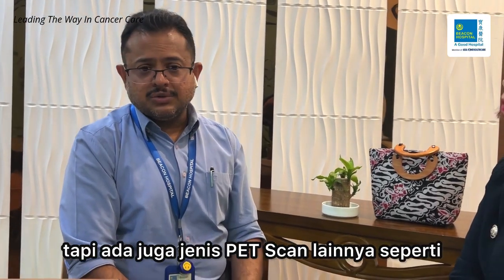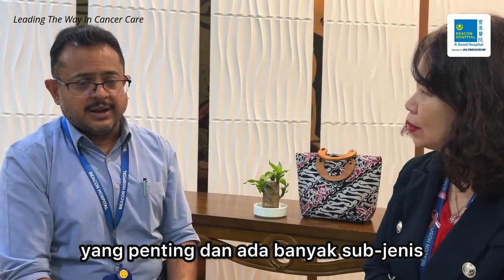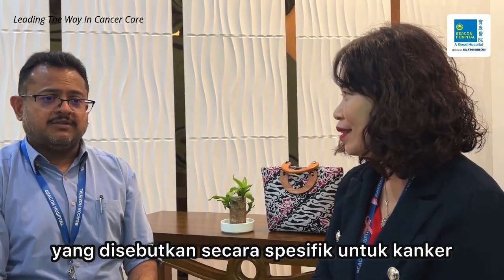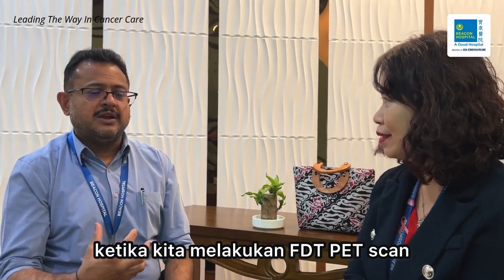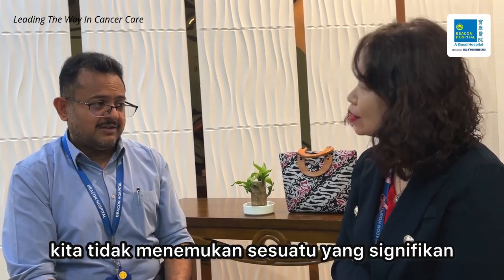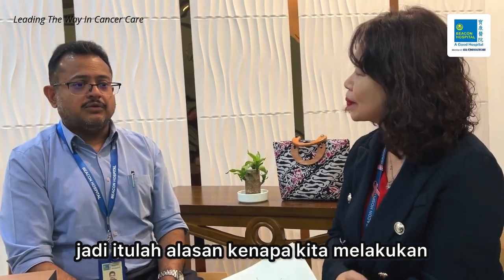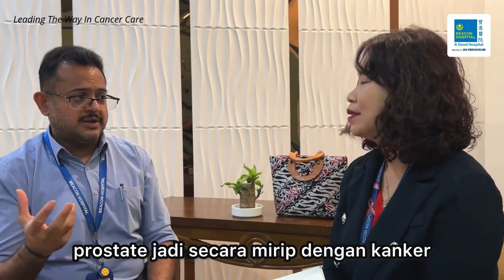But there are also other types of PET scans such as Gallium-68 PET scan, which is important, and there are many subtypes, like for example Gallium-68 PSMA PET scan, which is meant specifically for prostate cancer. Patients with prostate cancer, sometimes when you do FDG PET scan, you don't find anything significant. That's the reason why we do PSMA PET scan for patients with prostate carcinoma.